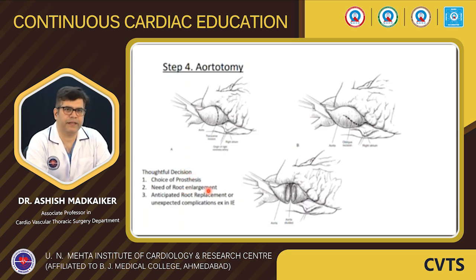Again, aortotomy is a thoughtful decision. It depends on many factors, like what kind of prosthesis we are using. If we are using a sutureless valve, then we need to make a very high aortotomy. So a transverse aortotomy which is made very high would be beneficial.